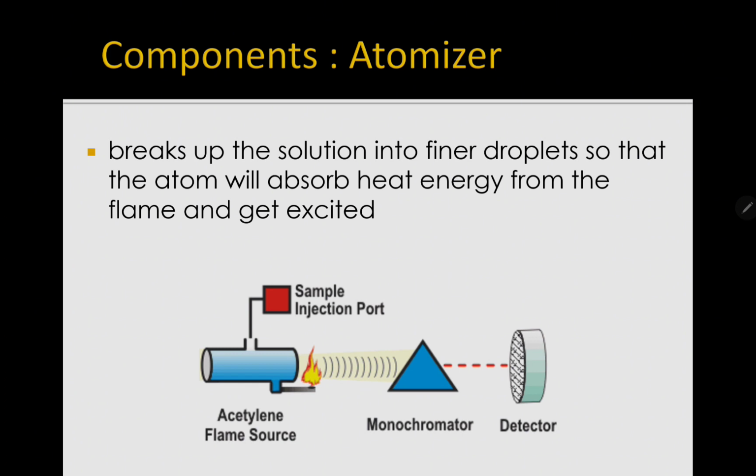Remember, ano yung mga ginatry natin at i-check dito? You have your sodium, potassium, lithium, di ba? Francium, rubidium, as well as your caesium. Okay, but nowadays, since meron naman tayong specific ion electrodes for those analytes, kaya hindi naman siya ginagamit ang flame emission, guys. Okay, kaya again, hindi na siya common ninyo makita sa mga laboratories. Tsaka hazard po din, meron kasing apoy.